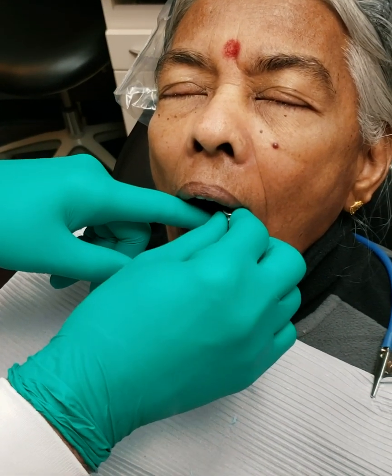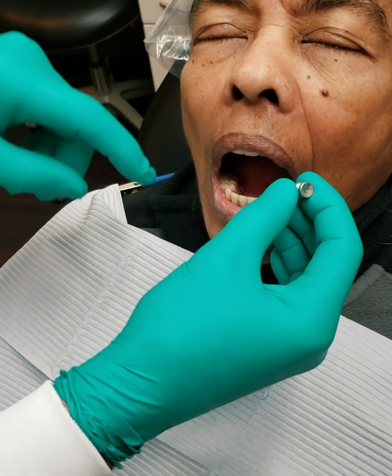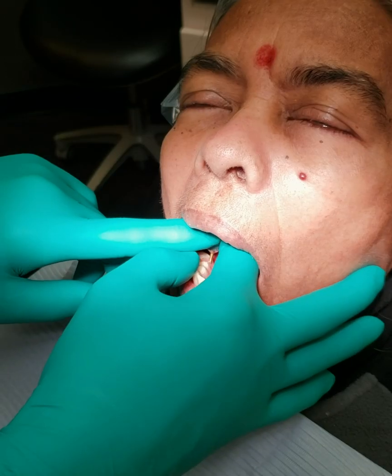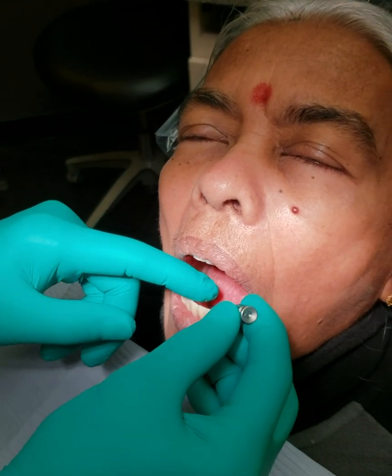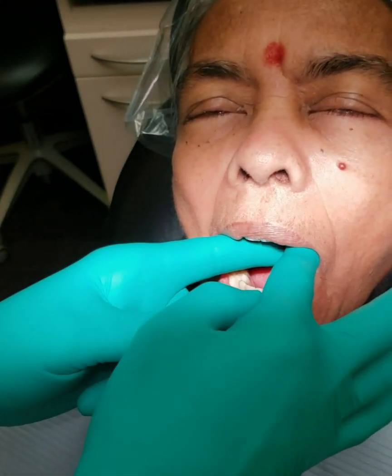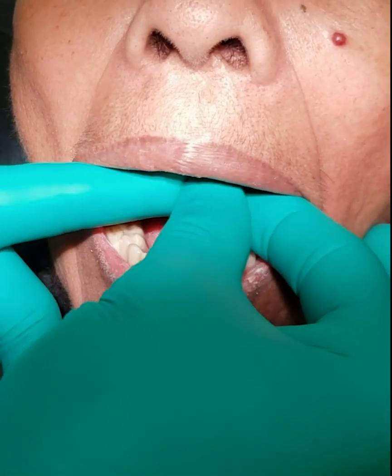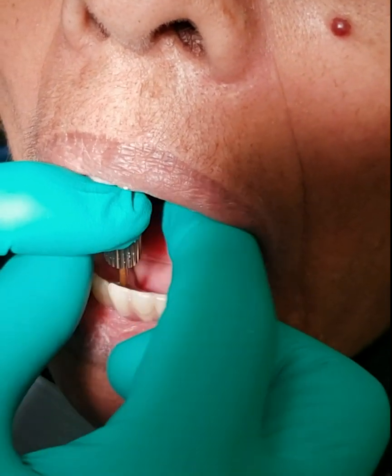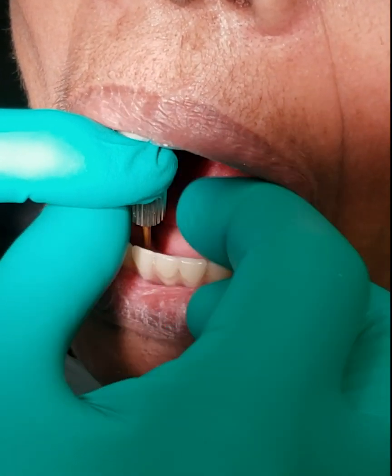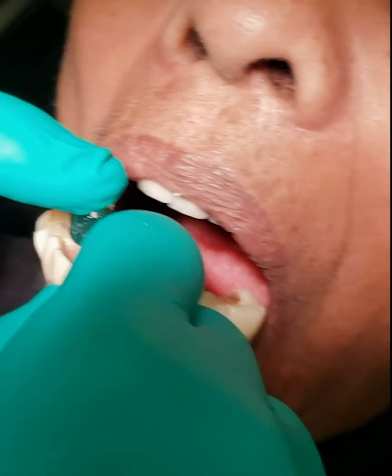First, what I usually do is undo one of the anteriors. Then I do posterior. Then I undo a second posterior. When you hear a click, it means that the screw is disengaged. Then I undo an anterior. Now, when this is removed from the mouth, make sure not to drop the screws. Keep it turned right side up. Remove it from the mouth.